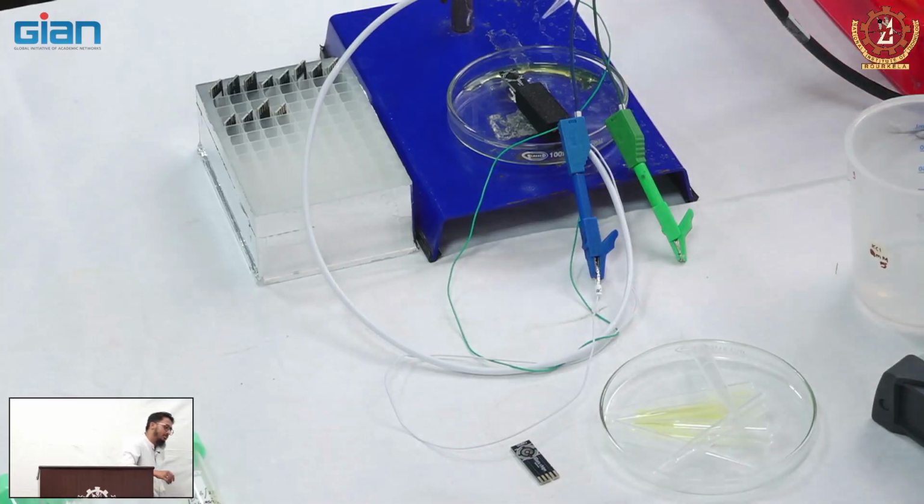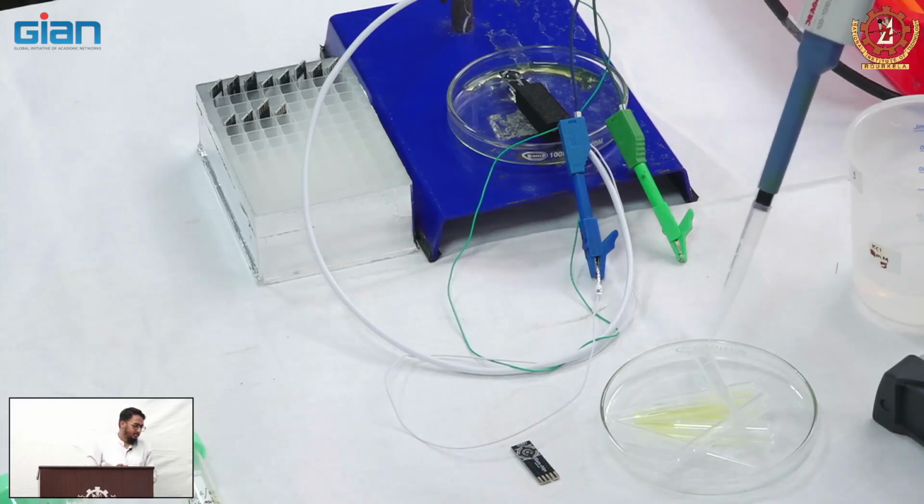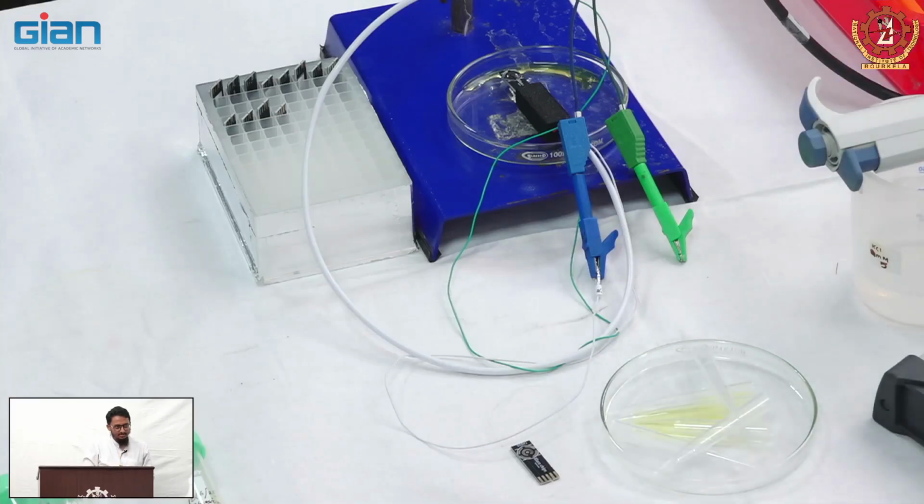I think there are air bubbles. Can you do the pipetting again? It's fine. Okay. So make sure that you are covering the entire surface of the electrode. So here we don't need to take the reading for 600 seconds. If you take for 1 minute also, it's fine. 30 seconds is also fine, just to get the current value. Ready? Okay, you can run it. Same parameters, same oxidation potential.